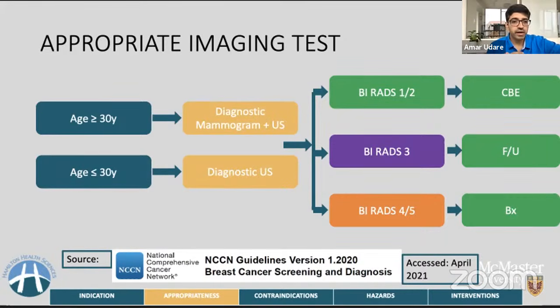So Zelda, that is a very good thing which you brought up for discussion here. It is really important to understand that there is no contraindication to offering mammograms if you are suspicious of breast findings. If the breast findings are not suspicious, the patient is under 30 years of age, and you feel confident on your ultrasound assessment that this is a BI-RADS 3 or BI-RADS 2 lesion, you can proceed with imaging follow-up. You can do a follow-up in 3, 6, 12, or 24 months to complete your assessment and downgrade that to BI-RADS 2. If you still feel that it needs biopsy, you may still biopsy that before doing your mammograms and always wait for the histopathology.